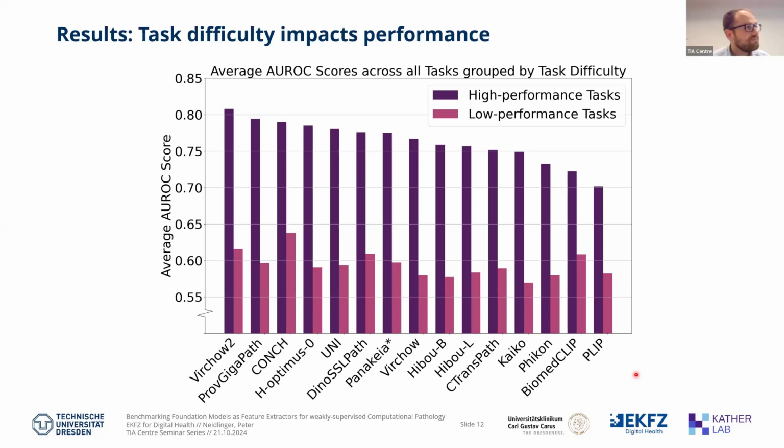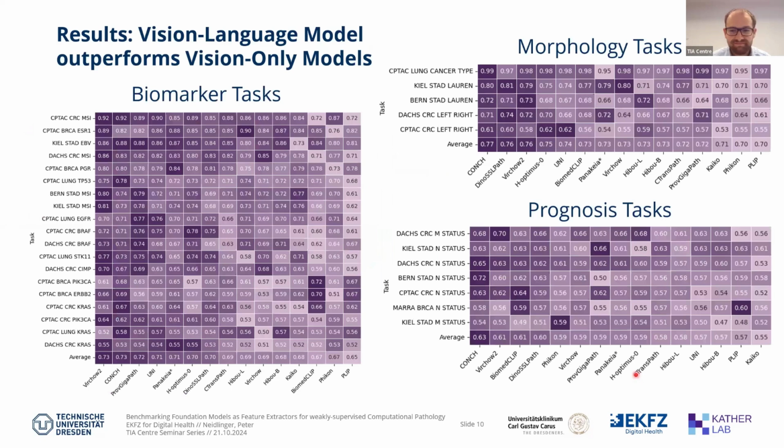I see. Would you mind going back to the first table you showed in this presentation about the different models? I'm wondering because I think you're ranking from the first row to the last row based on the performance, right? Based on the score from 0.9 something to 0.7 something, like on the table on the left. So is that because, and it's probably a naive question as well, different rows have different case numbers, right? So do you think it's because the case numbers may affect the performance as well?